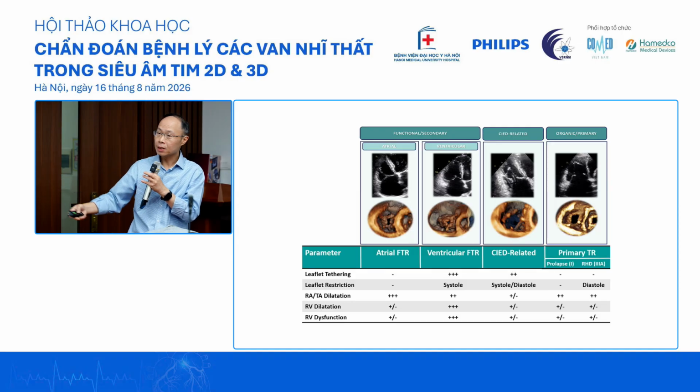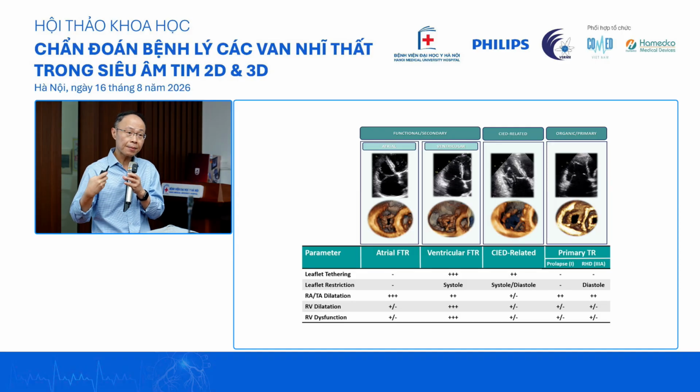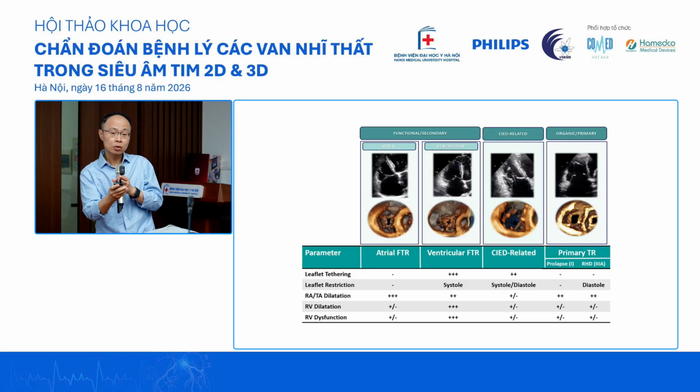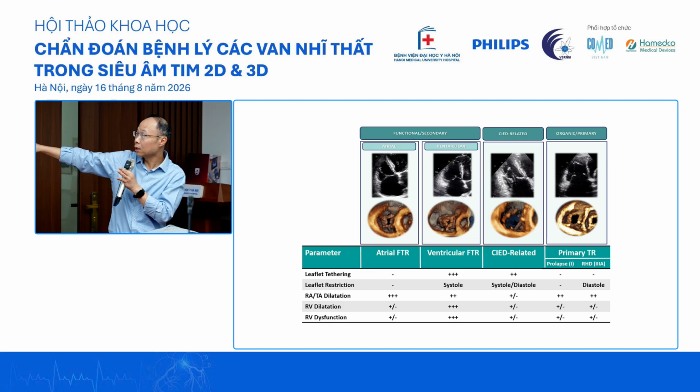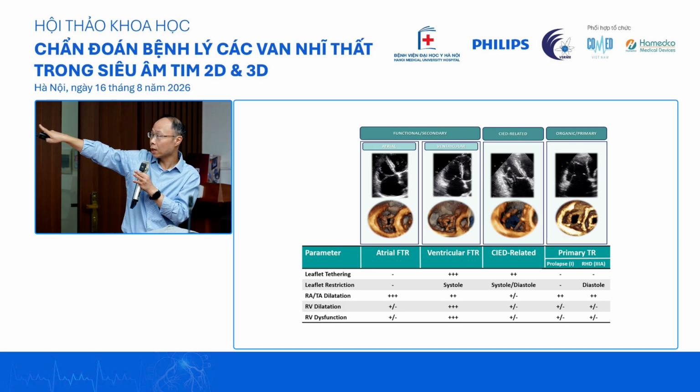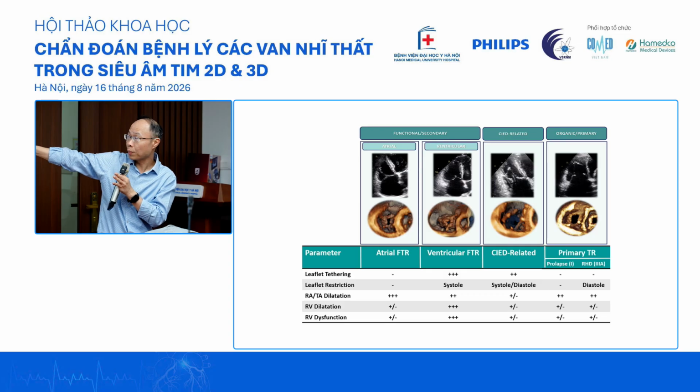So if there is an adhesion, if there's damage to the tricuspid leaflet, there's no clip again. But sometimes the lead is just there, and it is rough and impinged to the side. So as long as you have a clear gap over the anterior and septal leaflet, you can still put the clip way down and then just hold it there. And then in that sense, you can either maintain the lead all the way to the gap in between anterior and septal, or just park it right in the middle.